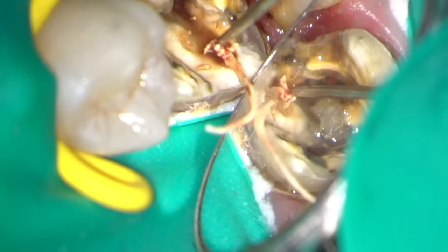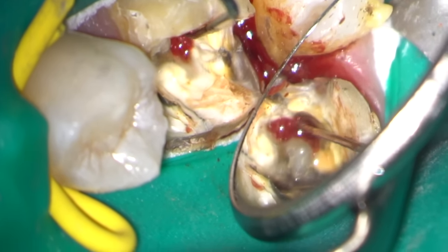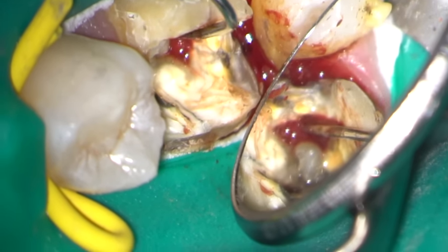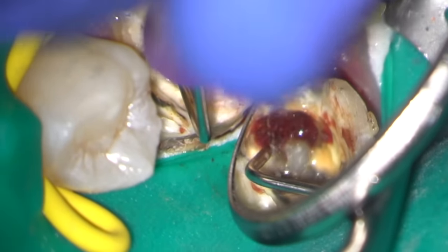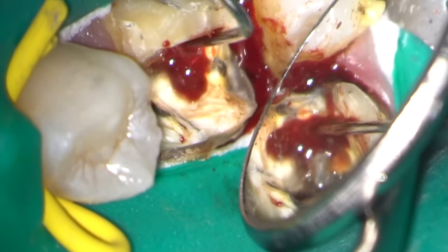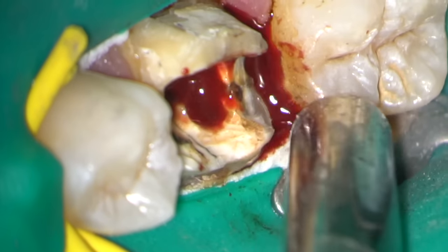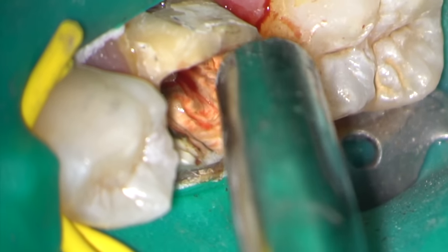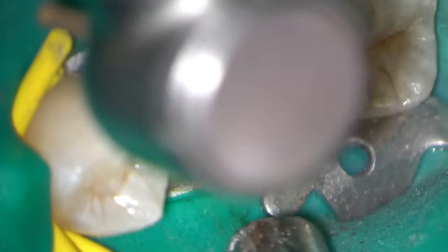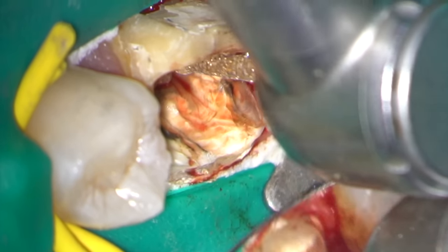As the material is removed, you'll see there's bleeding occurring. I haven't perforated. This is where that distal lesion has perforated the root canal, and it actually turns out to be a resorption lesion. I'm now going to use a diamond endo burr to expose the cavity, which almost extends down to osseous level.